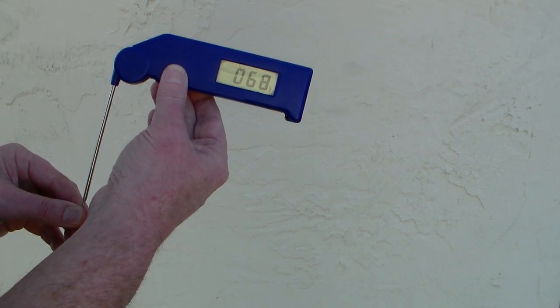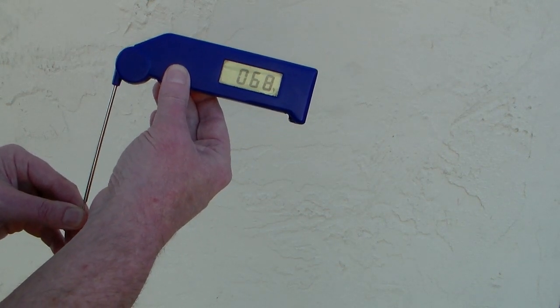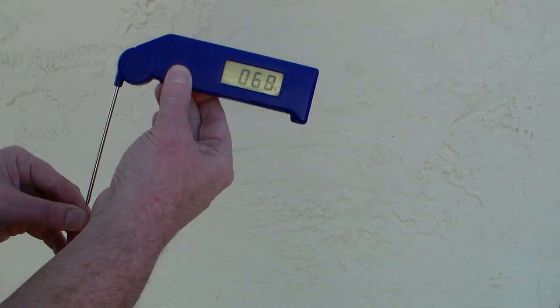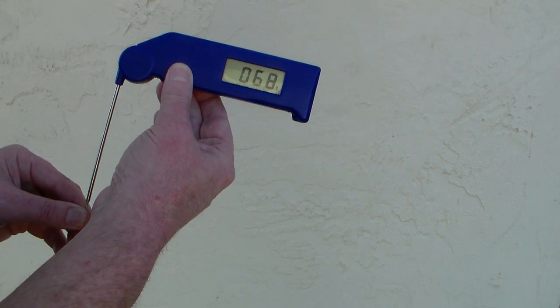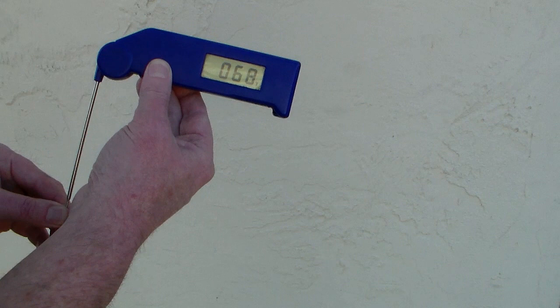Now, a normal person's body temperature is like 98.6. I did this to my wife and hers registered about 93, 94 degrees.